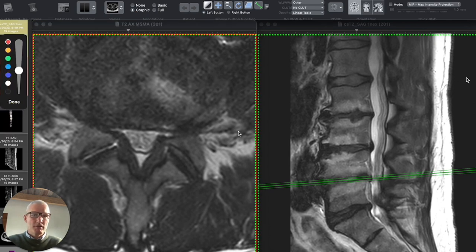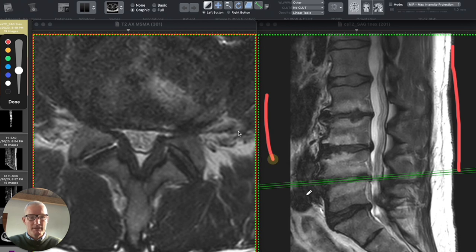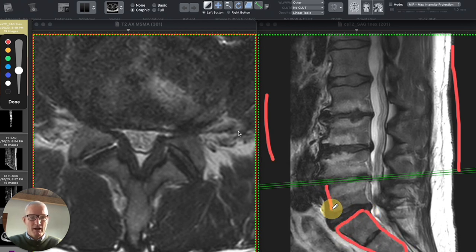This image that you see over here on the right is what we call the sagittal image. It's represented as if you were standing up. This is the skin of your back here. Your abdomen is down here. Down here we have the sacrum and on top of that we have five vertebral bodies that do not have ribs attached to them.